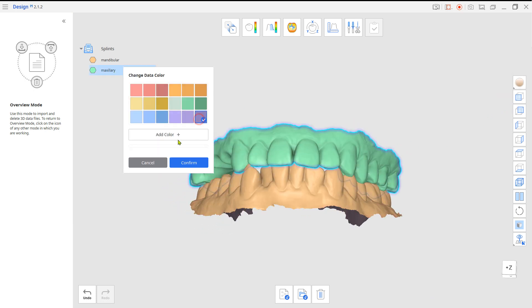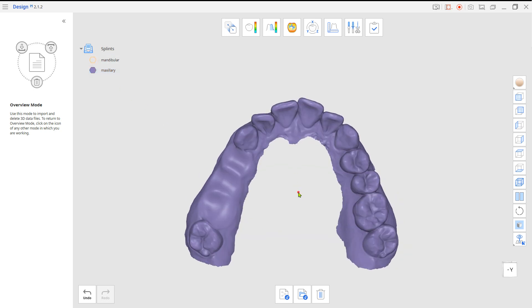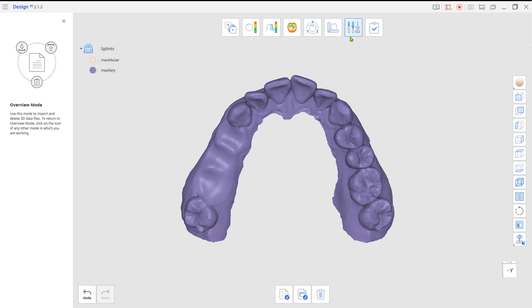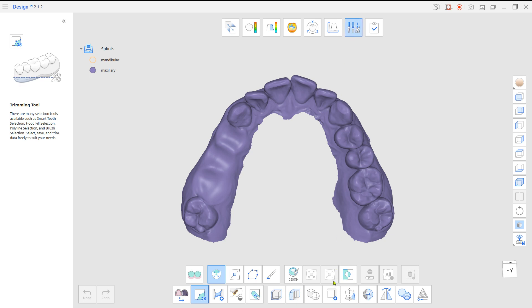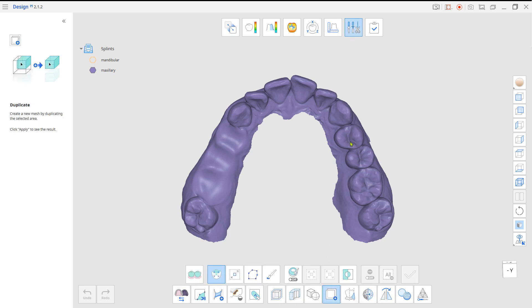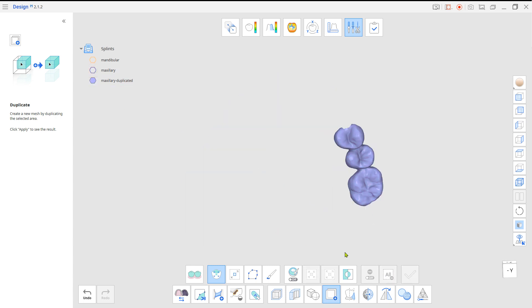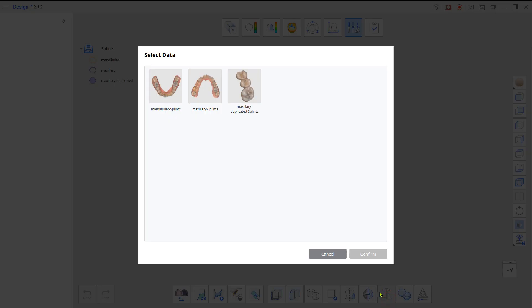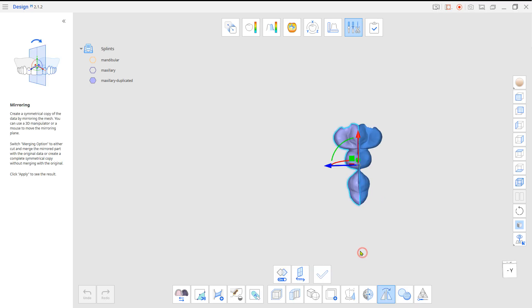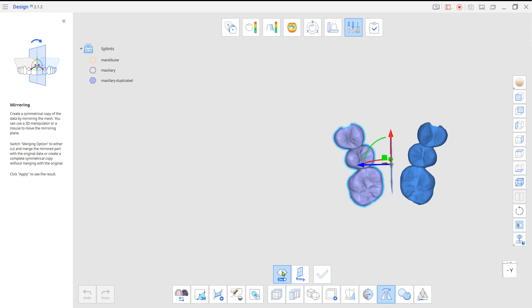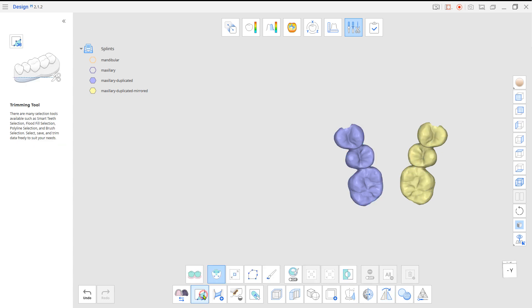To do this, load the scan data from the Design App. Go to Edit Mode and duplicate the same number of teeth from the other side. Then mirror the duplicated bridge.